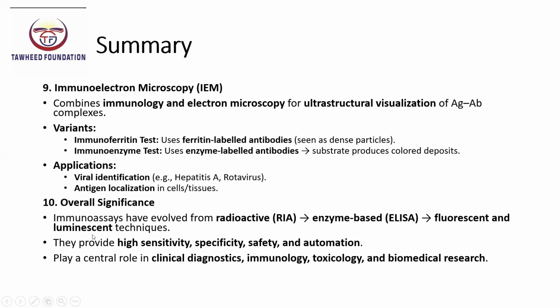So overall significance: immunoassays have evolved from radioactive, that is RIA, to enzyme-based, that is ELISA, to fluorescent and luminescent techniques. They provide high sensitivity, specificity, safety, and automation. They play a central role in clinical diagnostics, immunology, toxicology, and biomedical research.